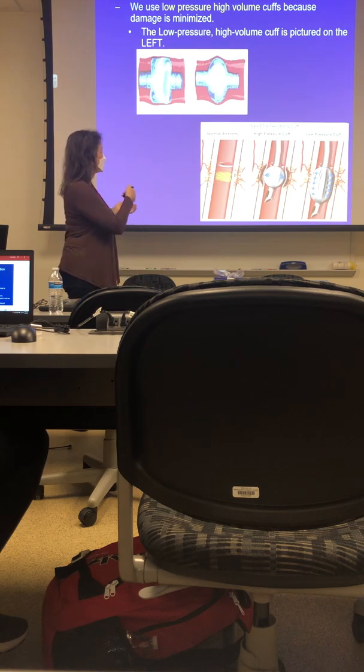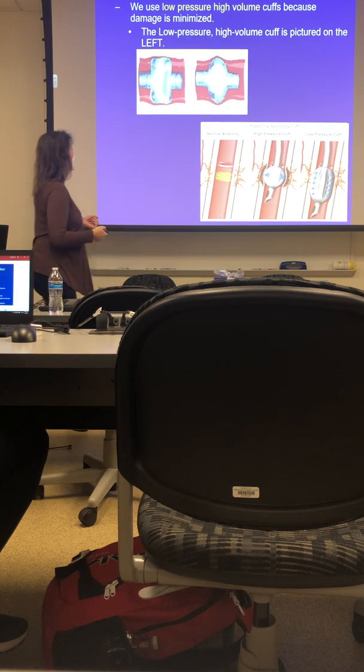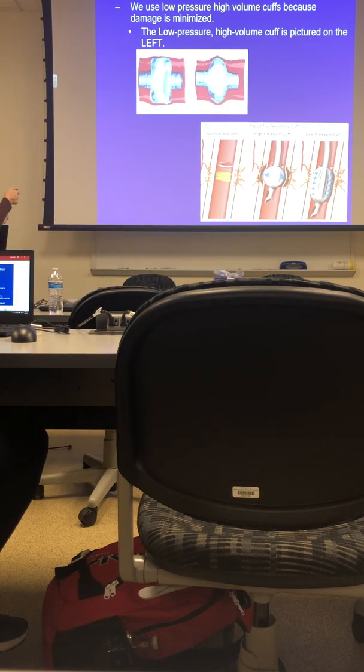They were saying it's high volume, low pressure, but it was the opposite. This is low pressure, high volume. This was high pressure, low volume. And I said, just remember you want low pressure so you're not creating too much pressure on those airways. So this is what we use, low pressure, high volume.